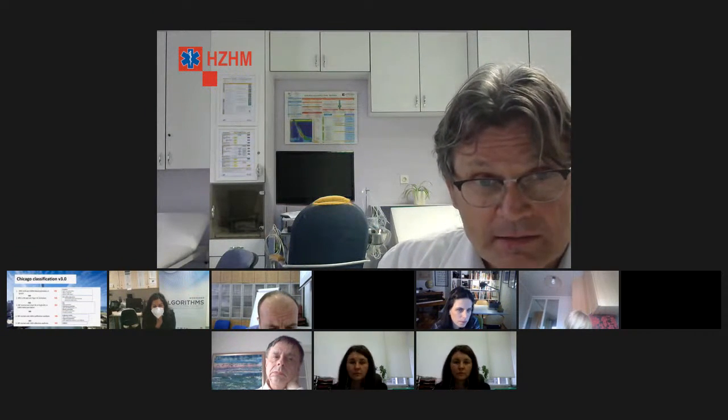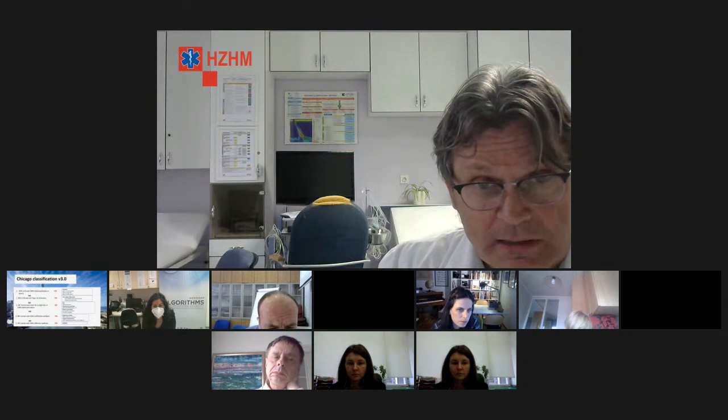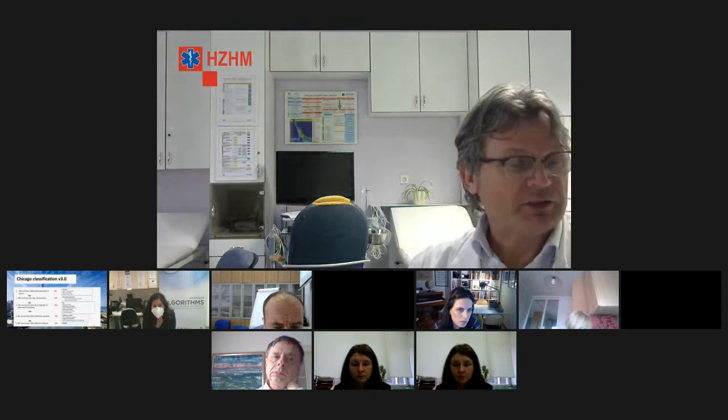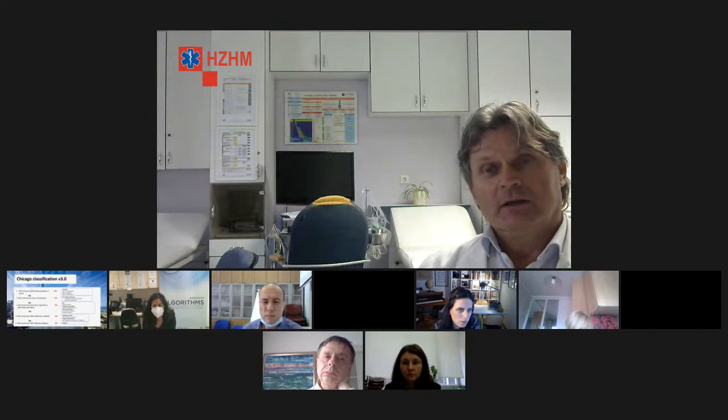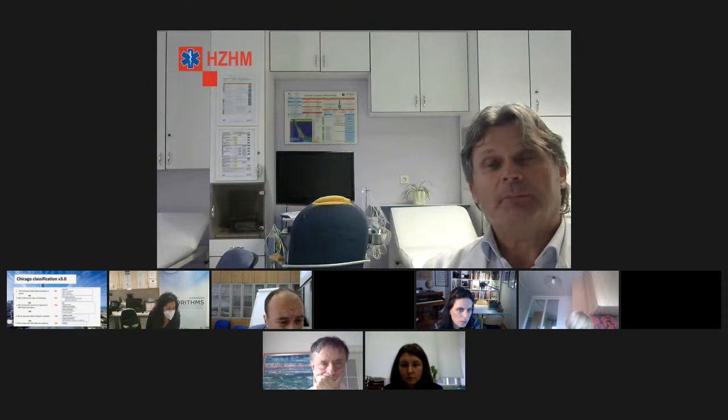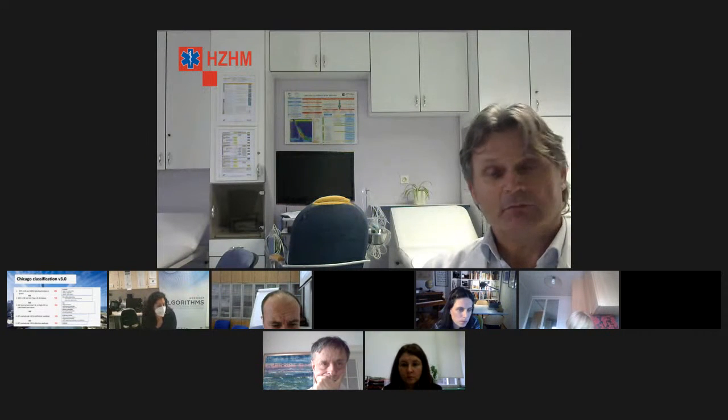Ja sam nekad radio 6-kanalnu manometriju, imali smo onaj aparat Grifona i to je bilo sasvim lijepo. Možda se lakše orijentirati s manje kanalnom manometrijom nego s ovakvim silnim zapisima. Dobro, ajde, ruku na srce.